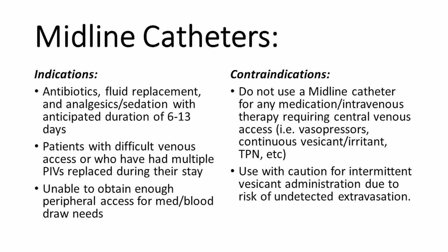In an emergent situation, all emergency medications may be administered via midline provided that the infusion is changed to a central venous access device as soon as it is clinically feasible. In the case of an occluded midline, TPA is not approved to resolve occlusions. An occluded midline will need to be replaced.